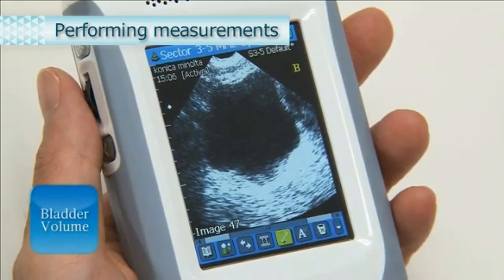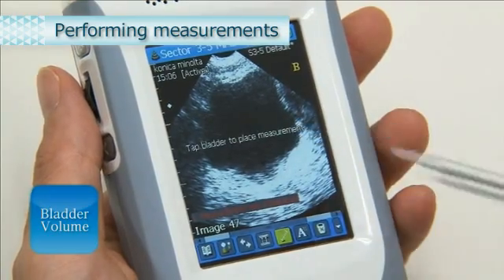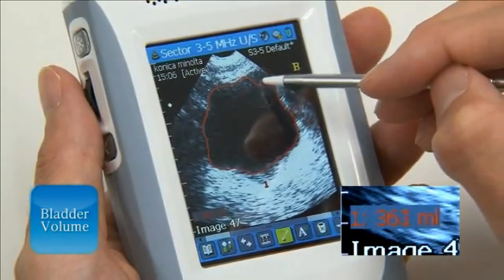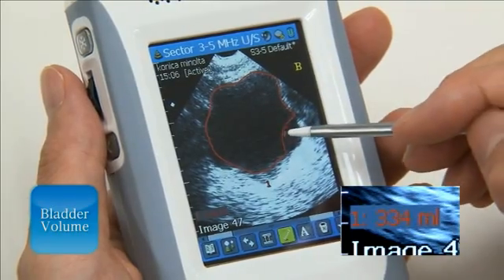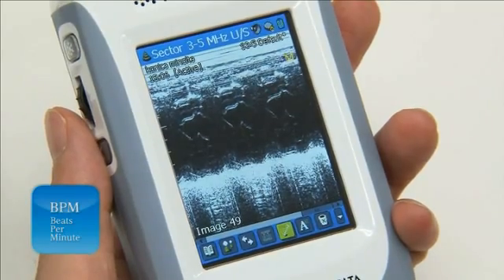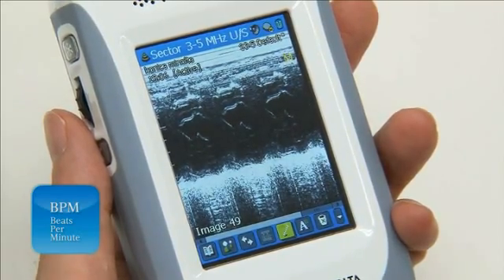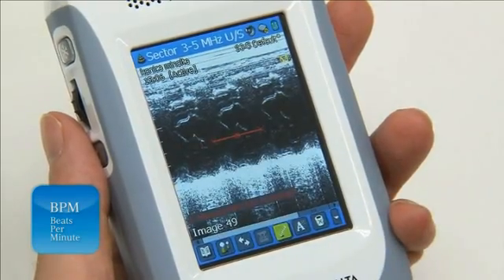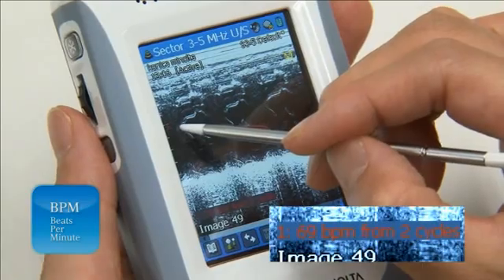For bladder volume, from the measurement pop-up menu, select Bladder Volume. Touch the center of the bladder with the stylus pen. An outline of the bladder is traced automatically. To adjust the trace line, drag it with the stylus pen. Beats per minute measures heartbeats per minute. This measurement can be performed in M mode or in PW Doppler mode. From the measurement pop-up menu, select the number of beats per minute cycles. In this example, two cycles are measured. Align the calipers with the cycles. The measurement value is displayed at the bottom left of the screen.